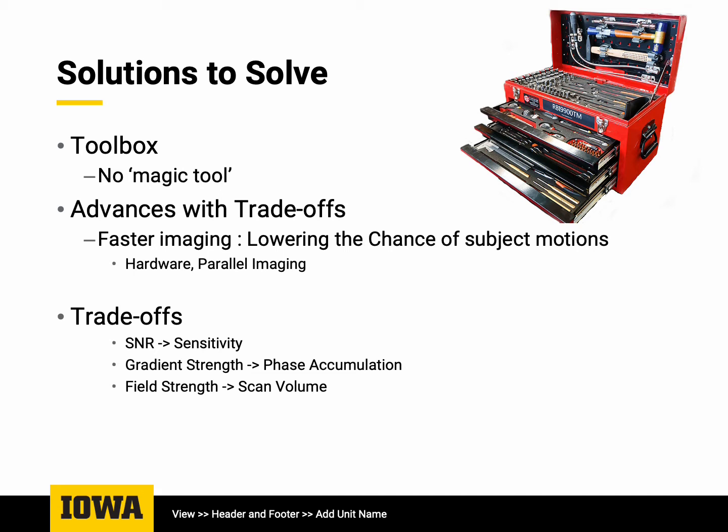As we increase our SNR, we're more sensitive. As we increase the gradient strength, we have a phase accumulation. And as we increase field strength, our scan volume changes. There's going to be no magic tool that will fix all of the different issues with motion in MR.